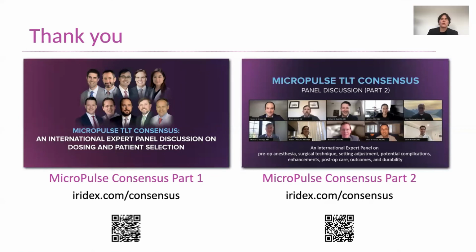Yeah, I think those are great comments. And I would just add for myself, I think the biggest thing is there's no shame in retreatment. If you had a safe first treatment and you need a little bit more, you advance the settings. Because as we discussed earlier, the recommended settings, I do believe everyone should start with that, but there's room beyond that too. So it's always better to start and be safe. And I've learned to be more consistent and compulsive in this technique as well. It's not just a 3-minute technique, it is, but the attention to detail, I think, does make a difference. And slowing the sweep speed is, as was said earlier, very hard to do. But I think it does make a difference.